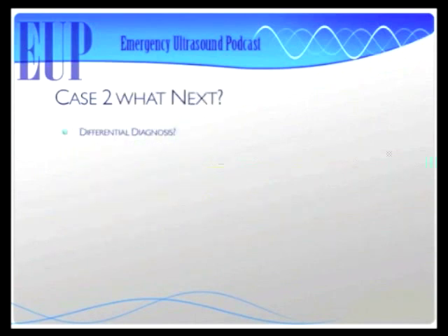This is the exact same case. He's got CHF exacerbation. We just had this case. So you're going to do an ultrasound to make sure, right? You don't just want to throw this guy on BiPAP just because you've seen a case with a similar presentation, right? No, that's how I practiced. The last case that I saw, I treated the same way.